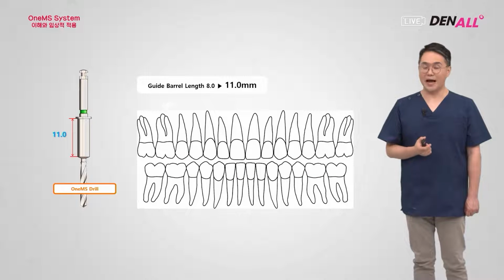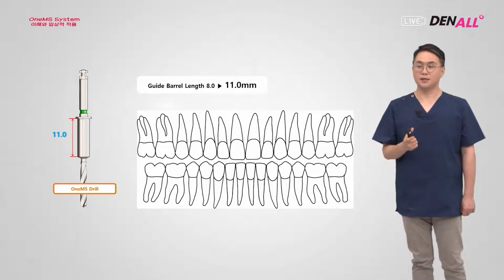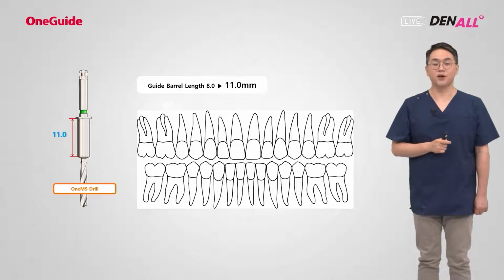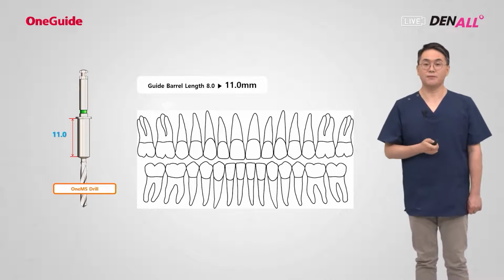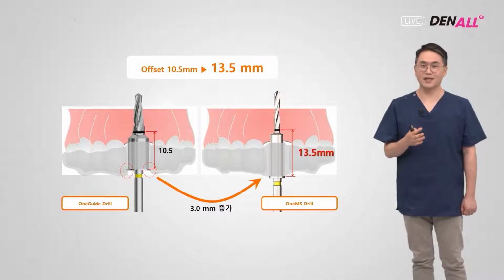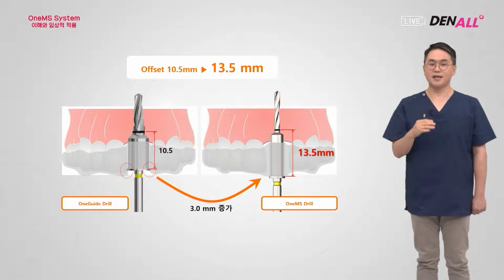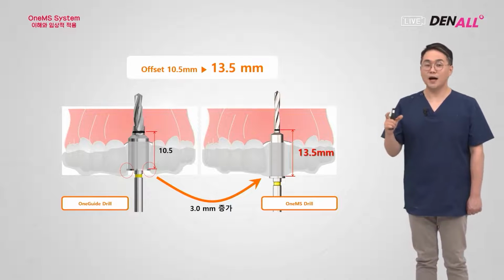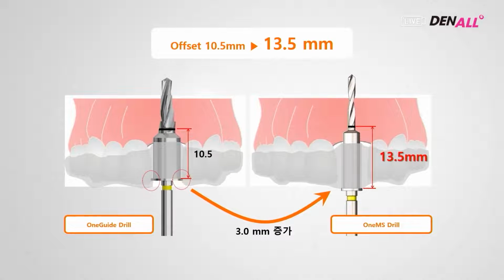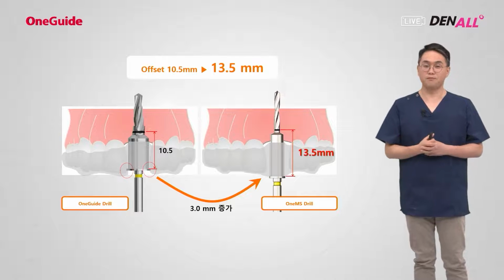This is because the mesiodistal distance is often very narrow. And to avoid interference from the adjacent teeth, the offset was extended. So the guide barrel has become longer. In the OneGuide drill, the guide barrel length was 8.0, but it's now extended to 11 millimeters because the offset is longer. In the OneGuide system, the offset was 10.5. Offset is the distance from the top of the implant to the top of the guided hole. So for the TS implant, if you place it with the OneGuide system, the distance is 10.5. But with this OneMS system, it's extended to 13.5, and the guide barrel length has also been extended. This is to avoid interference with adjacent teeth.